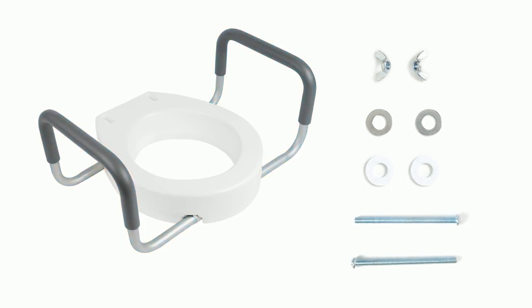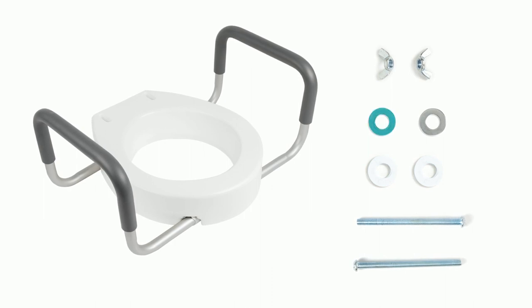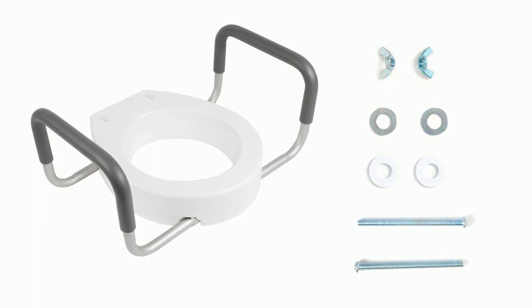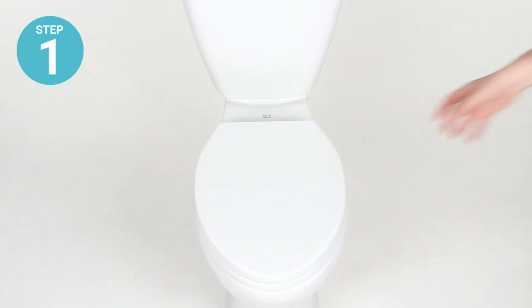Included with your order you will find one seat riser, two removable padded armrests, two long bolts, two plastic washers, two metal washers, and two wing nuts.